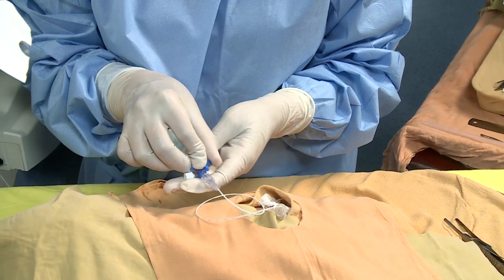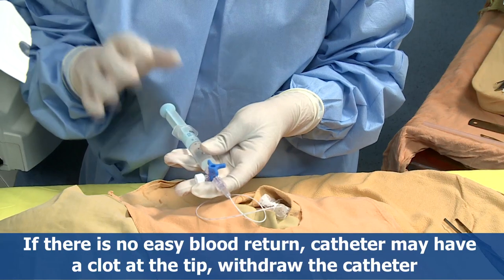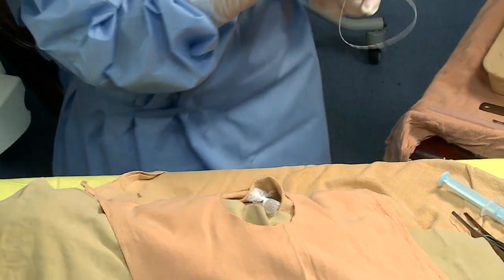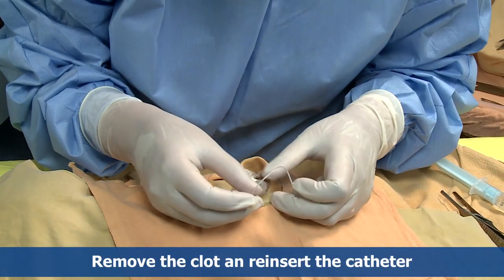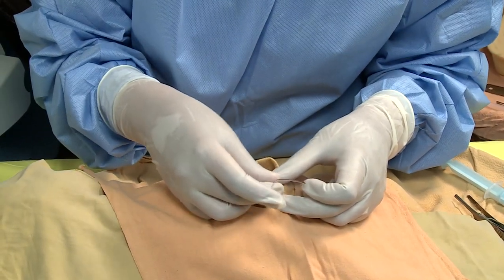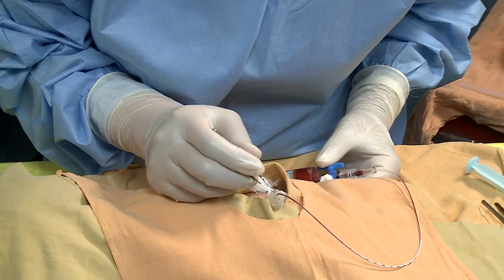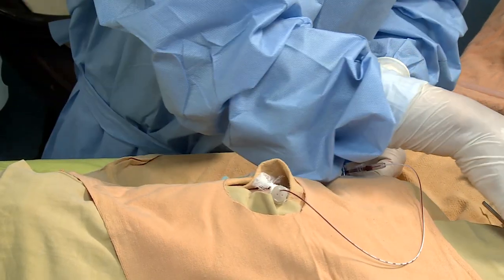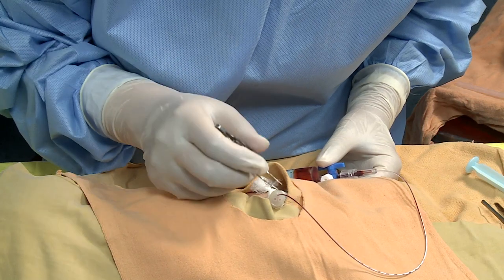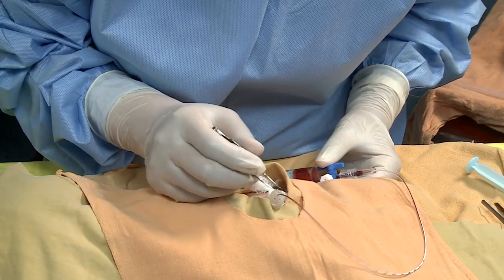Apply gentle suction to the syringe. If there is no easy blood return, the catheter may have a clot at the tip — withdraw the catheter, remove the clot, and reinsert. If free flow of blood is obtained, keep inserting until the desired length. If the catheter meets any obstruction prior to the measured distance, withdraw 2 cm, rotate the catheter, and reinsert to get rid of the obstruction.